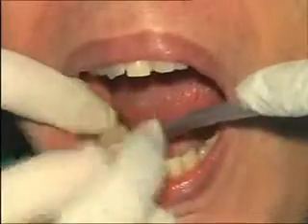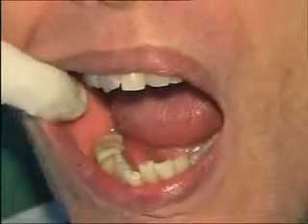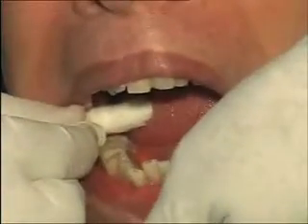External hex has now become extinct. Just like external hex implants are no more there, everything external hex gave rise to internal hex. Likewise, screw implants now will get eliminated and go to non-screw most of the time. Why wait? Bite when you have the technology available today. Bite please. Keep it closed. Thank you.